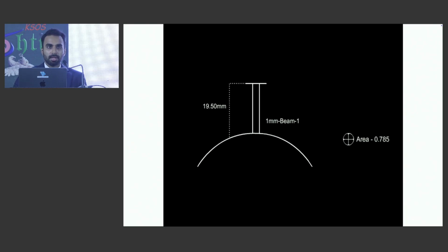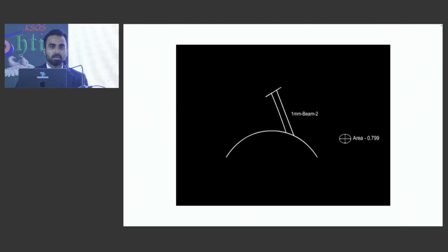This is a diagram of an excimer laser performing a treatment on a normal prolate shaped cornea. When the beam first hits the center, it's a very well spaced spot. There's no cosine effect. But as the treatment goes further towards the periphery, the peripheral spots are larger than the central spots. This leads to an uneven treatment zone. So the effective central treated zone is much tighter than the transition zone. This is what gives rise to spherical aberration, because the center is treated more than the periphery, and this effect compounds when you have higher degrees of myopia when you're treating.